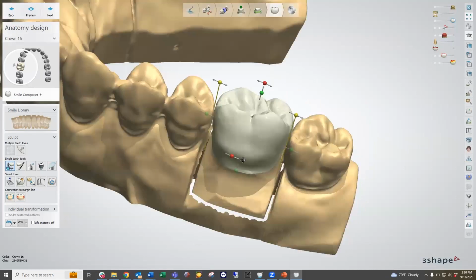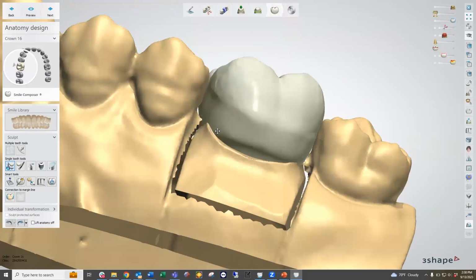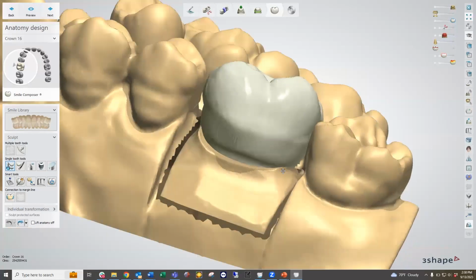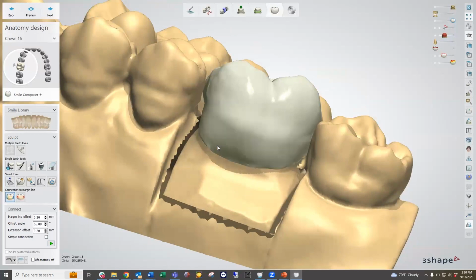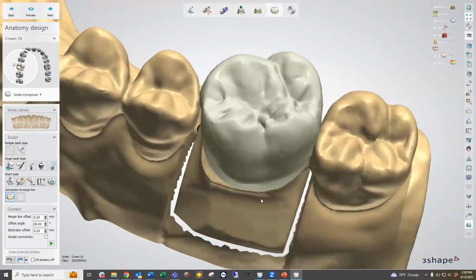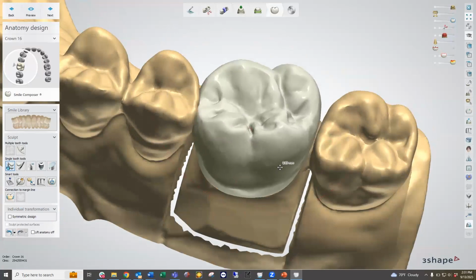One thing the software does automatically is suck it down to the margins, but I don't like to do that. I like to remove it from the margin line, which is this option here, connect to margin line. It basically sucks our unit down to the margin line. I like to undo that first. So this is what it would look like if we sucked it down to the margin line. I like to undo that totally, so I have an amorphous blob that I can work with and set into place. And then once I have it set into place, I connect it to the margin line.